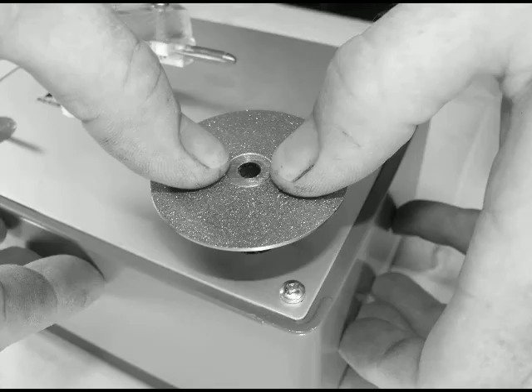To get started, you want to put the rubber disc on the machine as shown above. First, line up the flat side of the spindle with the under flat side of the disc to make sure that when you push down, the disc seats itself firmly upon the machine.